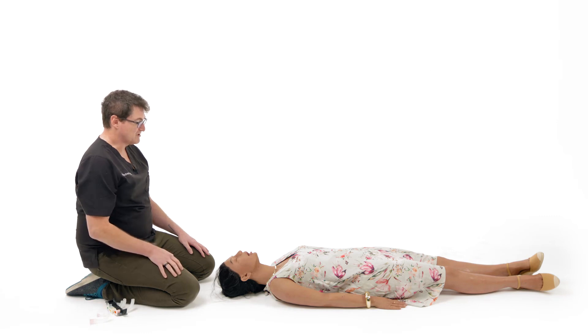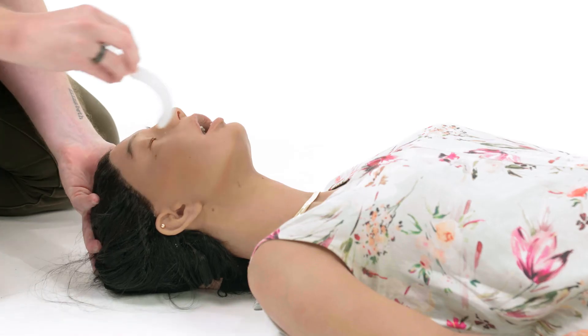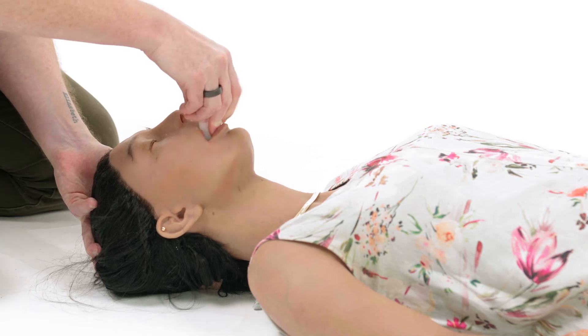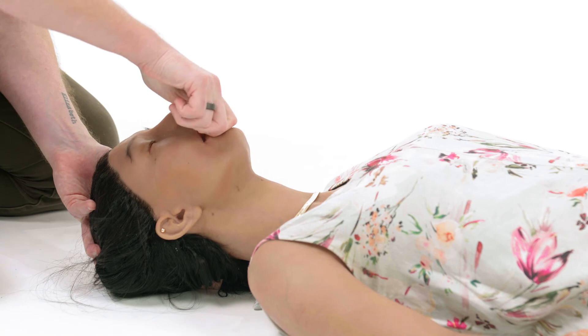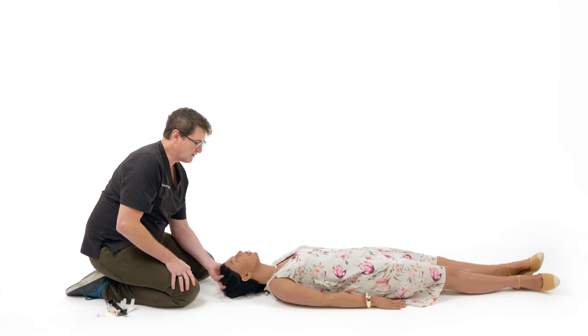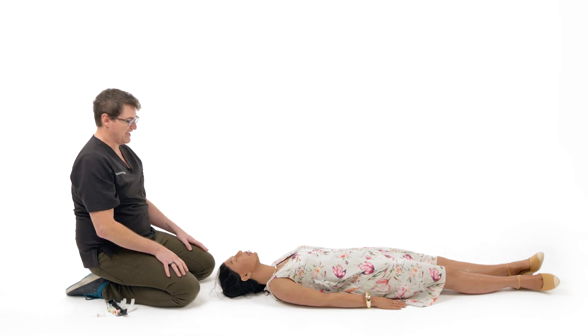Once we've appropriately sized the oropharyngeal airway, we can put it in place. Slide the oropharyngeal airway upside down, halfway down the back of the mouth, and twist 180 degrees. It will then sit in place, acting both as a bite block to prevent the tongue blocking the airway, and helps prevent the teeth from biting down on the tongue. The hands are then free to perform any other airway manoeuvres.